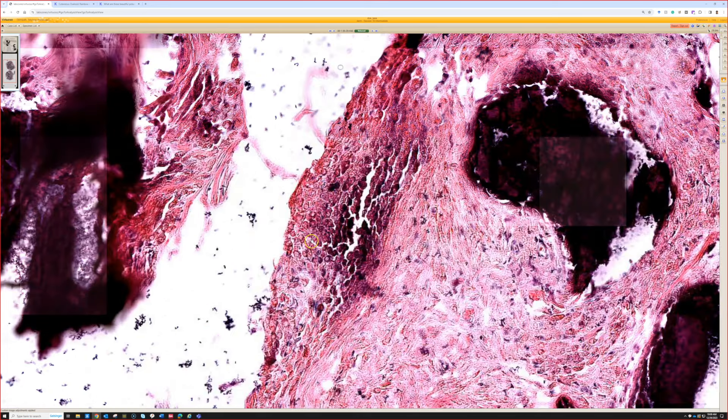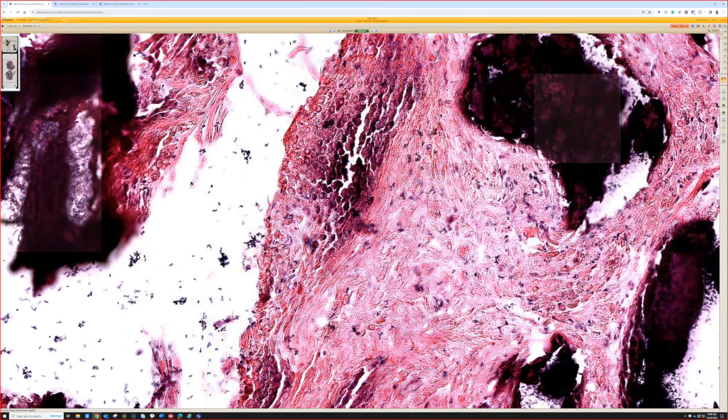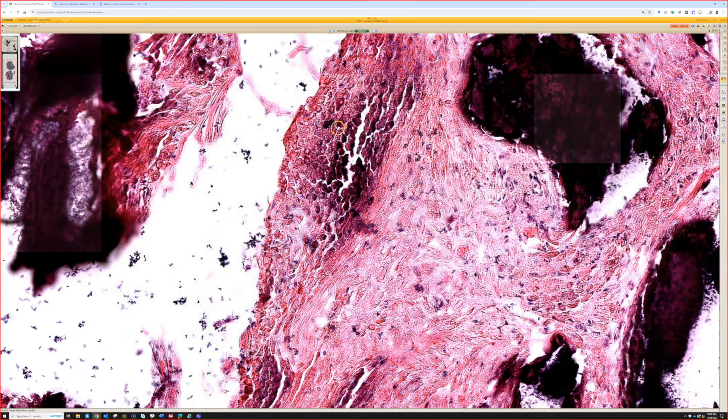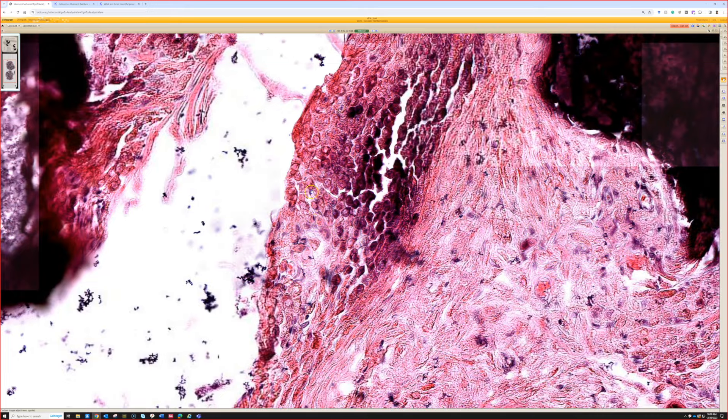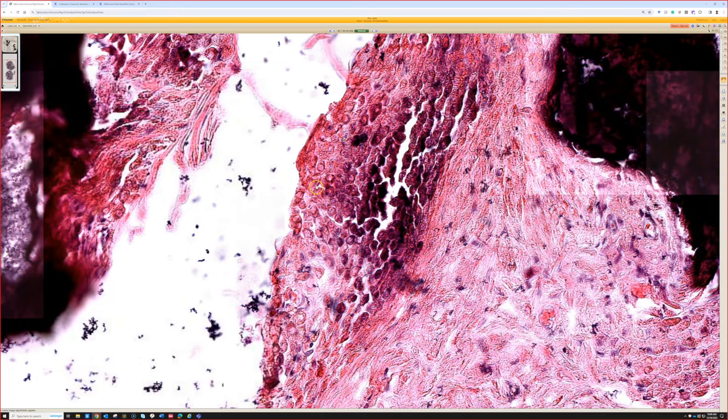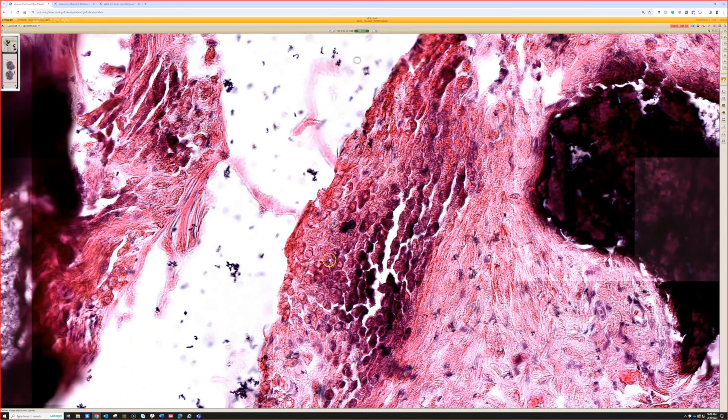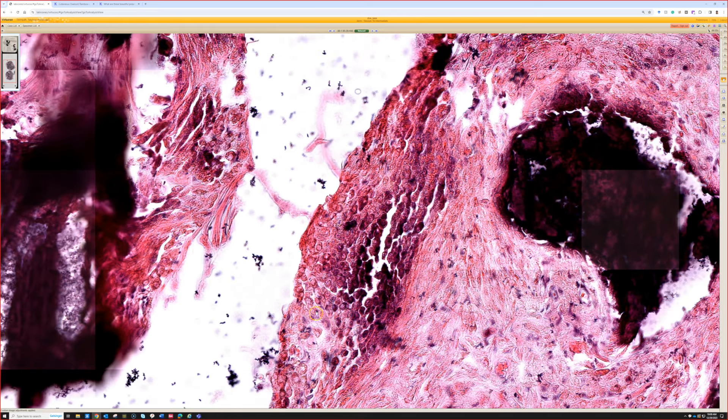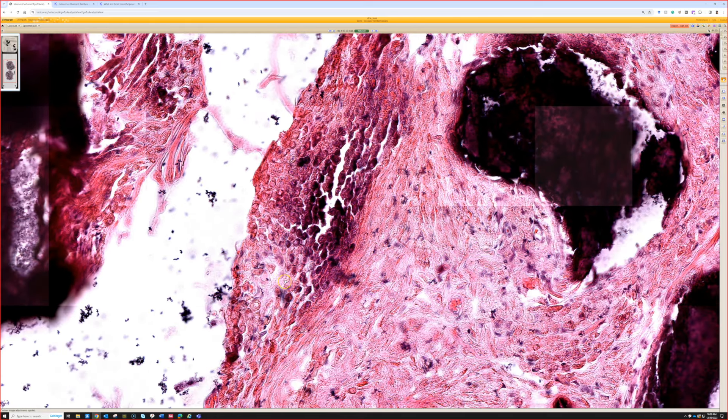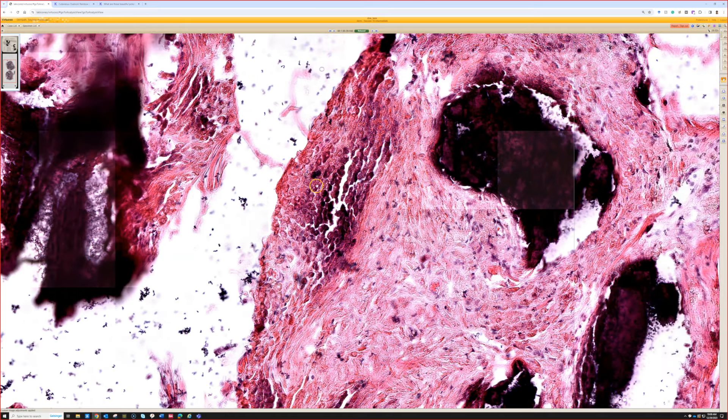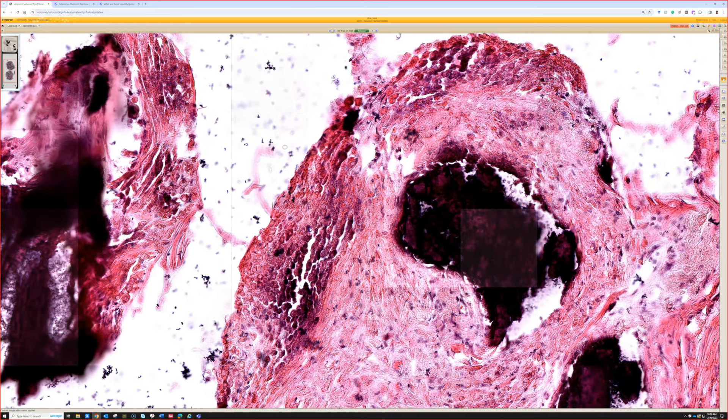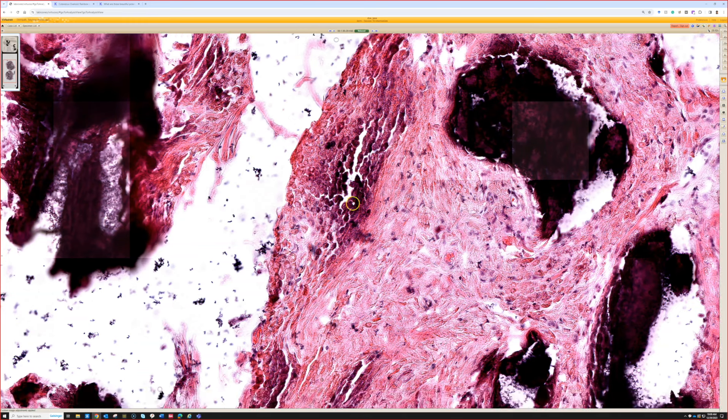These are sheets of dead keratinocytes, keratinocytes that are beginning to pick up calcium. These are called ghost cells or shadow cells, and this is the classic finding in pilomatrixoma. Pilomatrixoma, whichever you like, you can use a C or an X. I think pilomatrixoma looks cooler because it's got the X, but pilomatrichoma with the C is easier to pronounce for me at least. But do what you like.